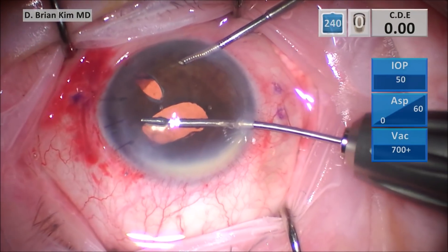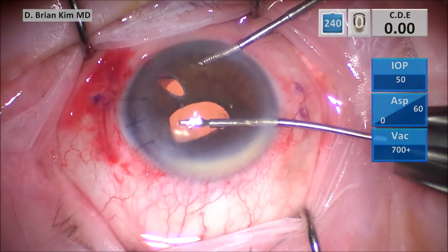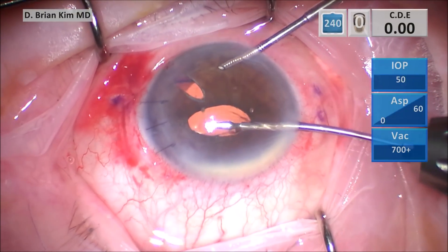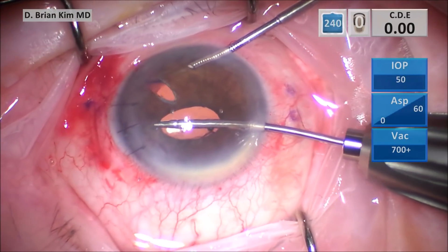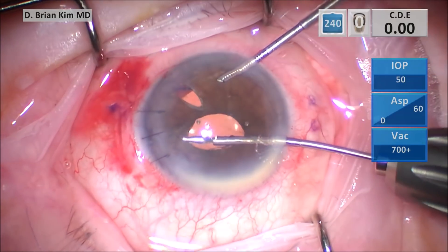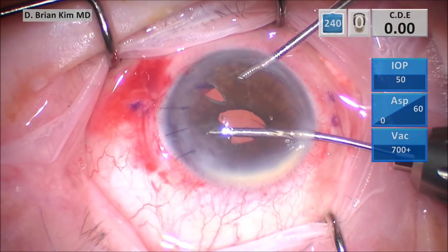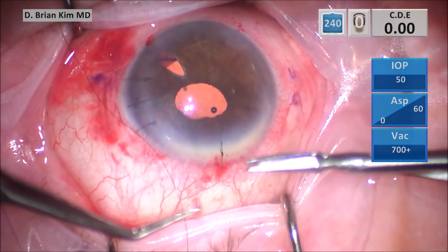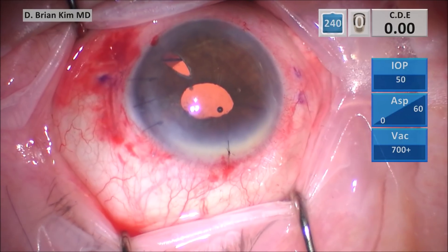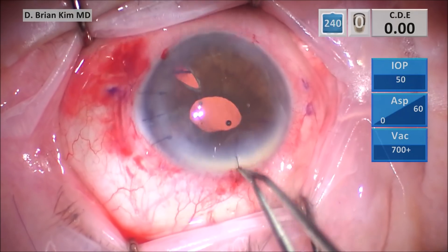Then closing the conjunctiva with some absorbable suture. I'm using some micrograspers to tease the iris. The iris, when it's been traumatized like that, tends to behave a little differently than normal iris, so you want to make sure that the suture rounds it out nicely. Make sure there's no iris that's incarcerated or bunched up. With just some gentle pressure, I'm grabbing that iris on the temporal side, making sure it rounds out nicely. Then I put a 10-0 nylon suture through the main incision and bury the knot. Then I'm going to put some subconjunctival antibiotic.